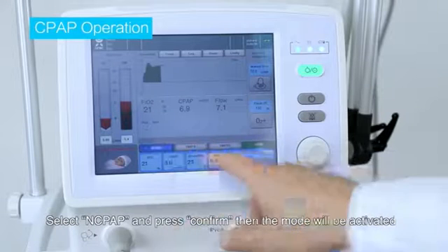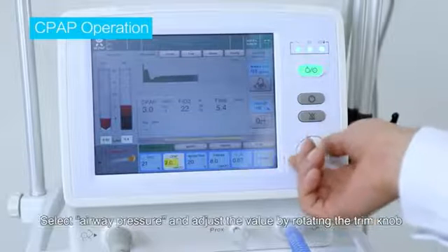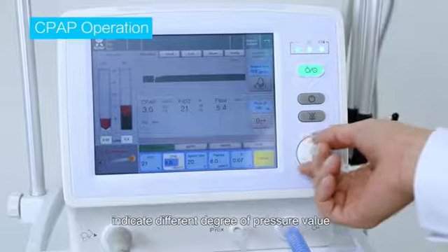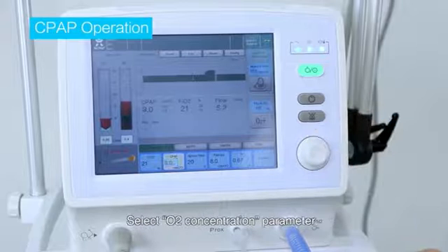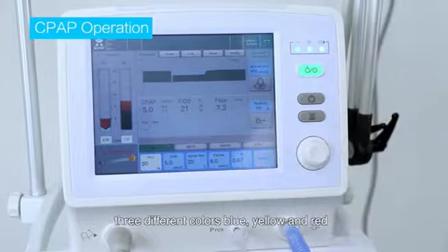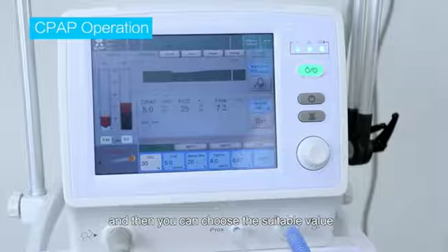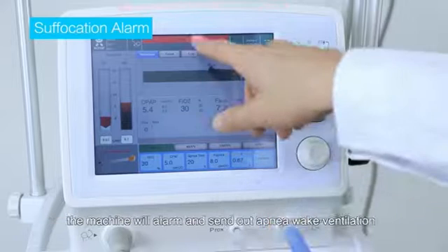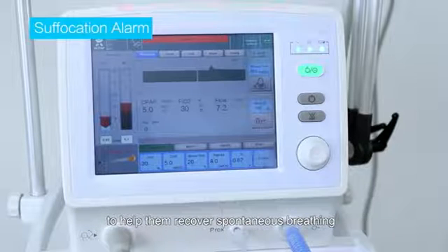Select NCPAP and press Confirm, then the mode will be activated. Select Airway Pressure and adjust the value by rotating the trim knob. 3 different colors blue, yellow and red indicate different degree of pressure value, and then you can choose the suitable value. Select Oxygen Concentration Parameter and adjust the value by rotating the trim knob. 3 different colors blue, yellow and red indicate different oxygen concentration, and then you can choose the suitable value. When the children apnea time surpass the default suffocation time, the machine will alarm and send out apnea-wake ventilation to help them recover spontaneous breathing.